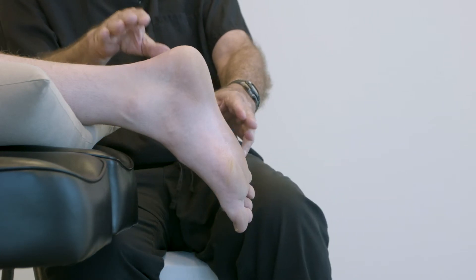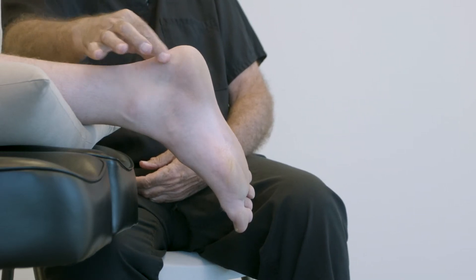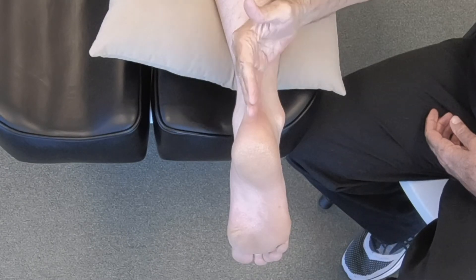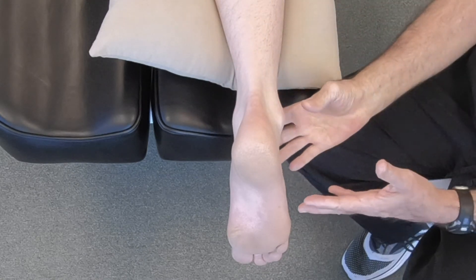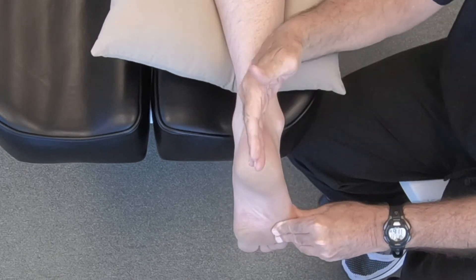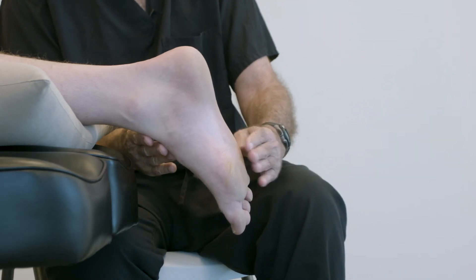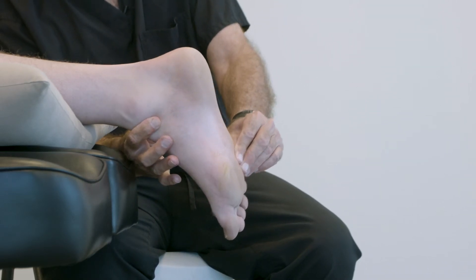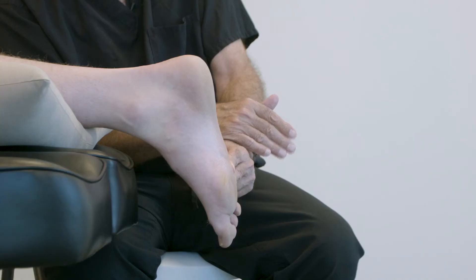We now have the same patient in a prone position, which allows excellent visualization of this critical relationship of the calcaneus to the lower leg. This is a much better angle to take a scan, and in some ways is a better position for the patient even when doing a fiberglass or plaster cast, because the practitioner gets good visualization of where the calcaneus is relative to the leg. It's just a little more awkward in terms of loading the mid-tarsal joint and finding subtalar neutral.